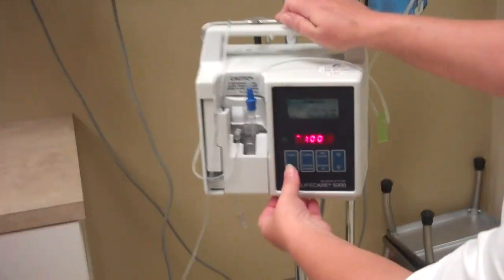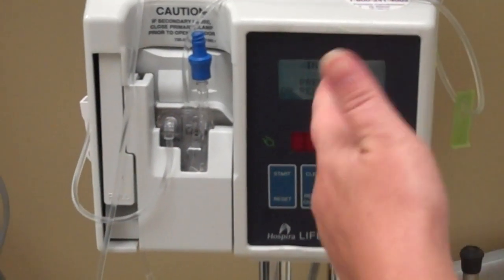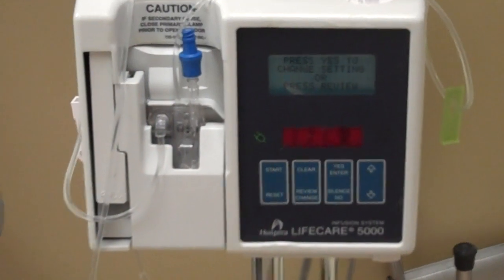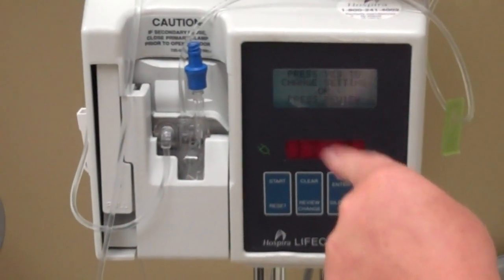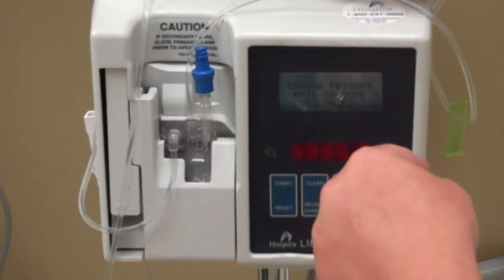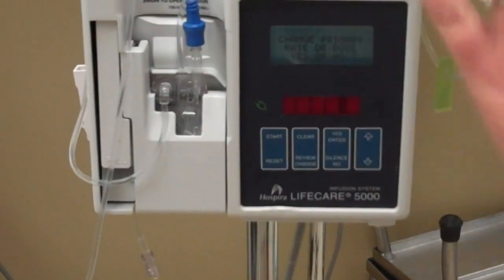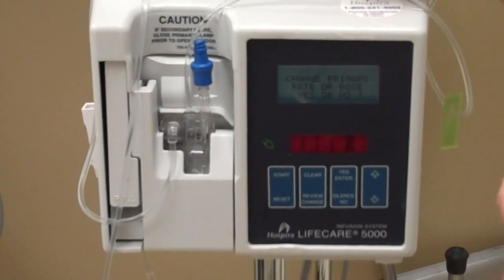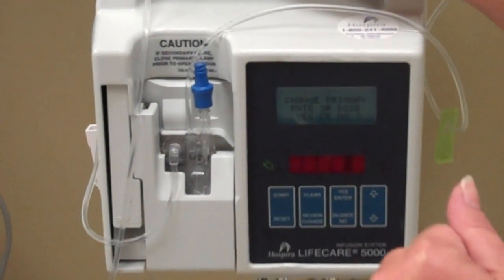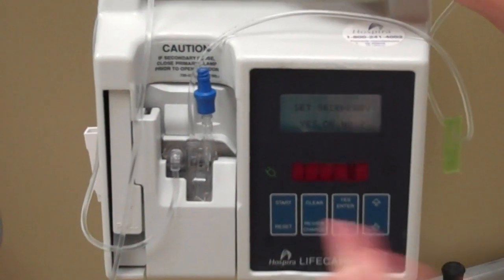All we need to do is hit reset. It says it's in reset — you either want to press start or review change; we want review change. It says press yes to change setting. Yes, I want to change the setting. Change primary rate or dose? No, I don't want to change the primary — I'm going to let it run. As opposed to the Alaris, the primaries run at the same time as the secondaries, whereas on the Alaris the primary is cut off, it runs the secondary, then the primary picks back up. So no, I'm going to let the primary run by itself.